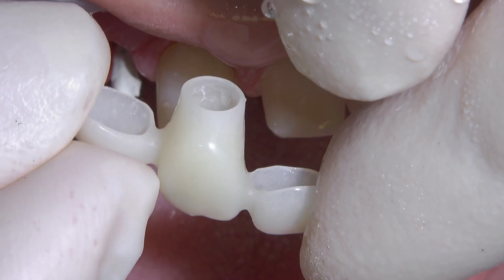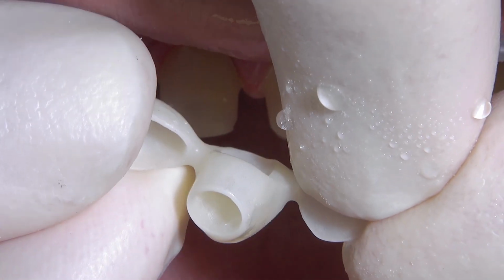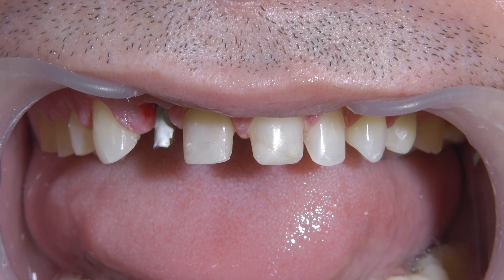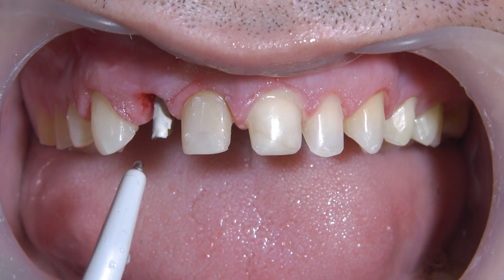You see here, just a simple thing, but it helps a lot with the composite. So just small retentions inside with a round diamond burr, and then we move to capture the position. Let's clean and dry.